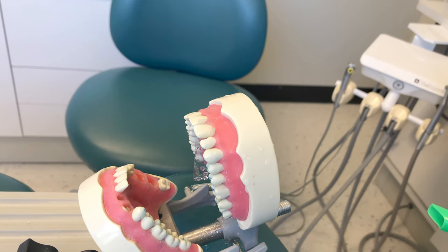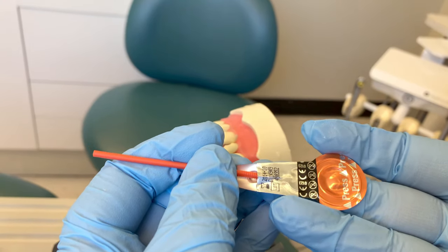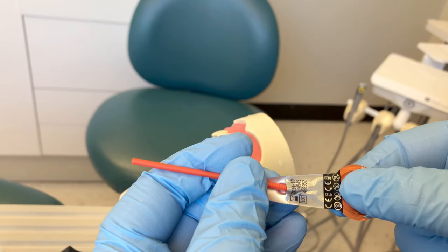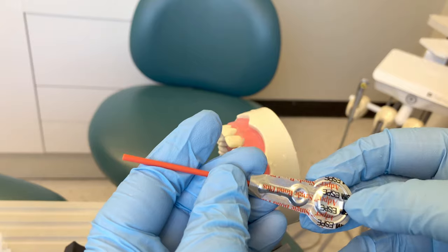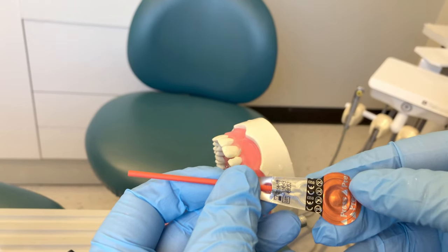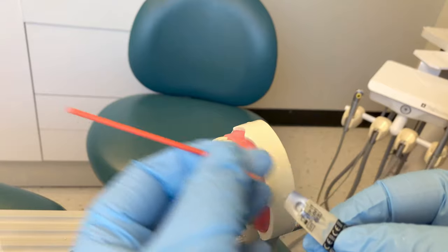Once the tooth has been etched, rinsed, and dried, you're ready for the next material: your bonding agent. This is our primer and bonding agent — a combination material called single bond. We activate it by pressing the circle and then pressing the second smaller circle on the back, then agitate your brush in and out of that well. You could also use a bottle dispenser and dispense it into a well with separate microfiber brushes.